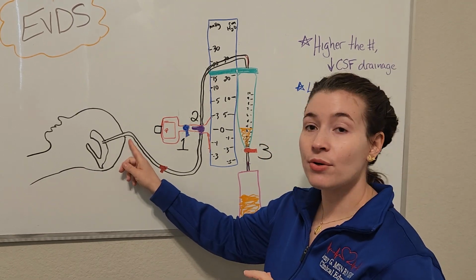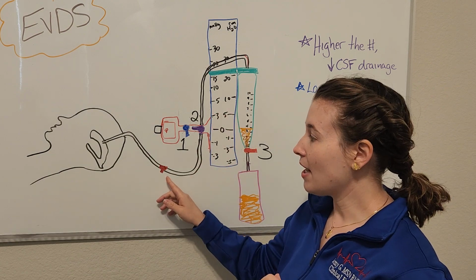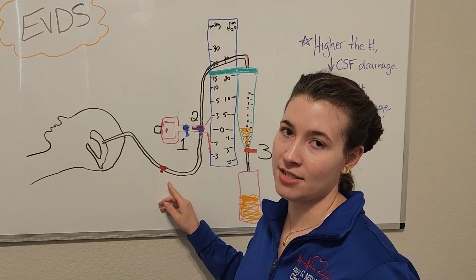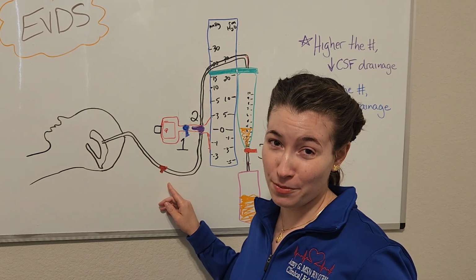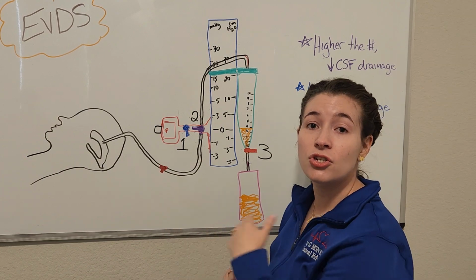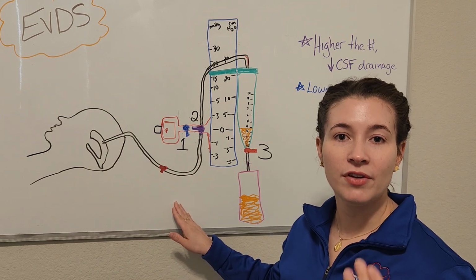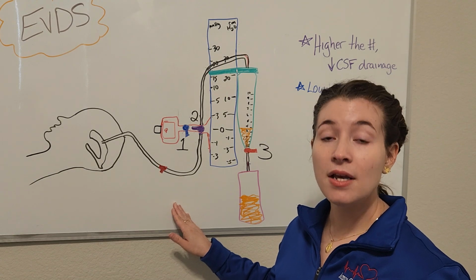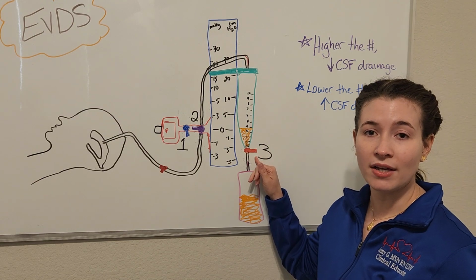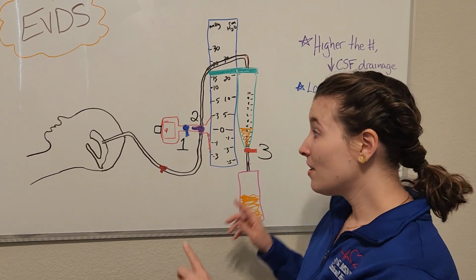Now, that catheter is going to be attached to pressure tubing that then connects to the drain itself. This portion of the pressure tubing does have a sampling port that the providers can use to instill medications as needed, but that's only for the providers, not for us. This is also an option that we can use to sample CSF to send to the lab, but you would only use this port if it's part of your unit policy on EVDs. The other option that we can use for CSF sampling is this port over here that's directly under the buretrol. So please make sure that you're looking at your unit policy on EVDs so that you know which one you would be using.